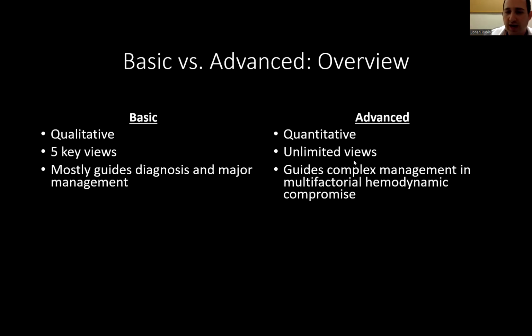basic echo usually guides diagnosis and major management when you find these major things. And these are important skills to have, right? We have to be able to find a pericardial effusion that's causing tamponade. We have to be able to find a completely newly acutely blown RV, right? And so there's nothing wrong with having that skill set. It's important to have that skill set.